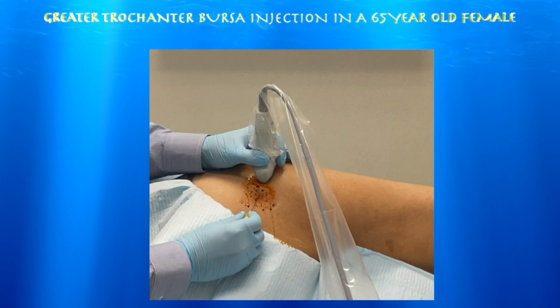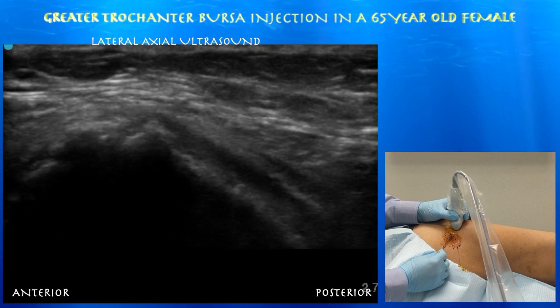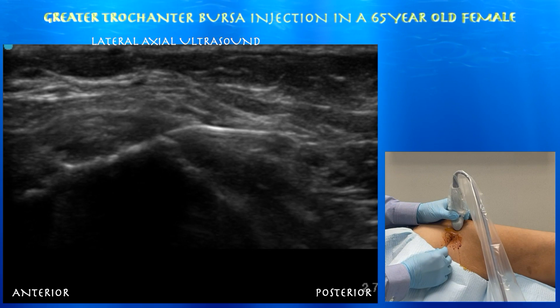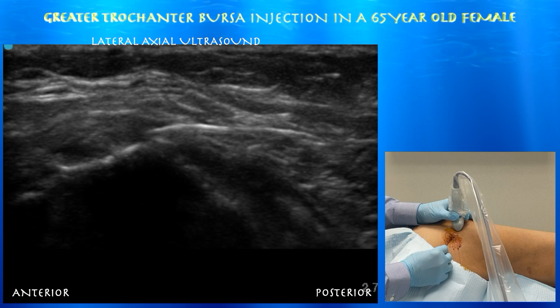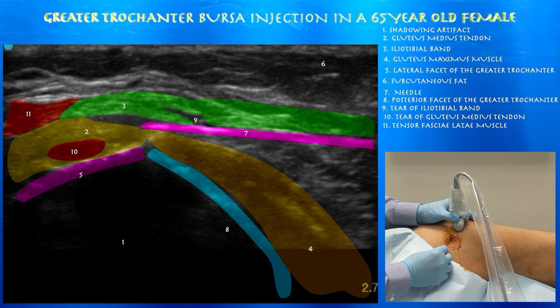Here we are starting the procedure using a 20-gauge spinal needle, roughly two and a half inches long. This is an in-plane approach going from a posterior to anterior direction. You can see the needle on the right side of the screen, essentially just heading towards that lateral facet. You can see the posterior facet to the right and below the needle, and it's basically heading right above the gluteus medius tendon between that and the iliotibial band. There may also be some intrasubstance tearing of that gluteus medius tendon.